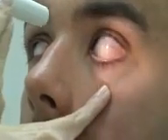Next, you're going to be lighting the conjunctiva and sclera, and to do that, you're going to have your patient follow instructions to look up and to the right, up and to the left. Same thing on the other side, up and to the right, up and to the left, while you light the lower conjunctiva and sclera.